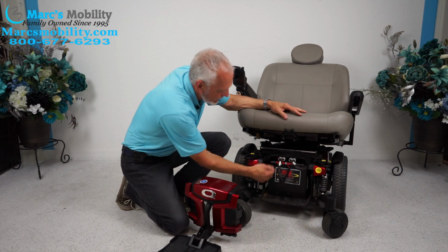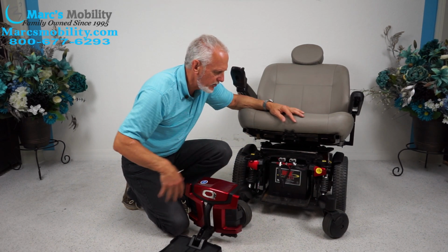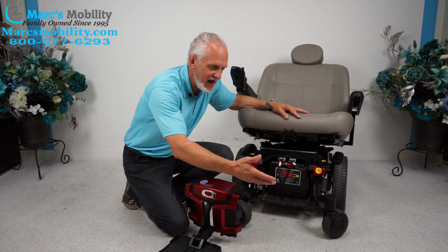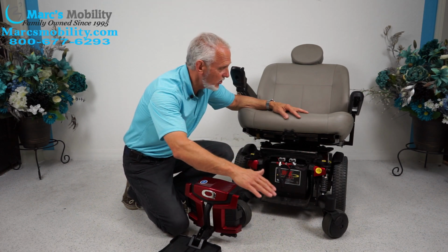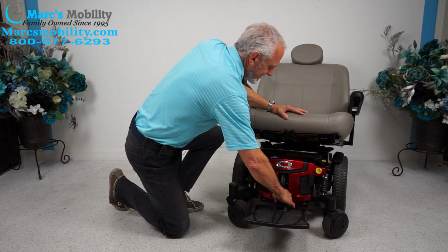So you have 2 batteries in here, 75 amp batteries in here. So that'll give you your 10 to 15 miles on a battery charge. Now, of course, if you have a large person on here, you may not get the 15 miles. You might get 10, 8, 12. It all depends how you use your chair, what kind of surface you're on, and the weight of the user. But it does have big batteries, which will give you the extended distance.